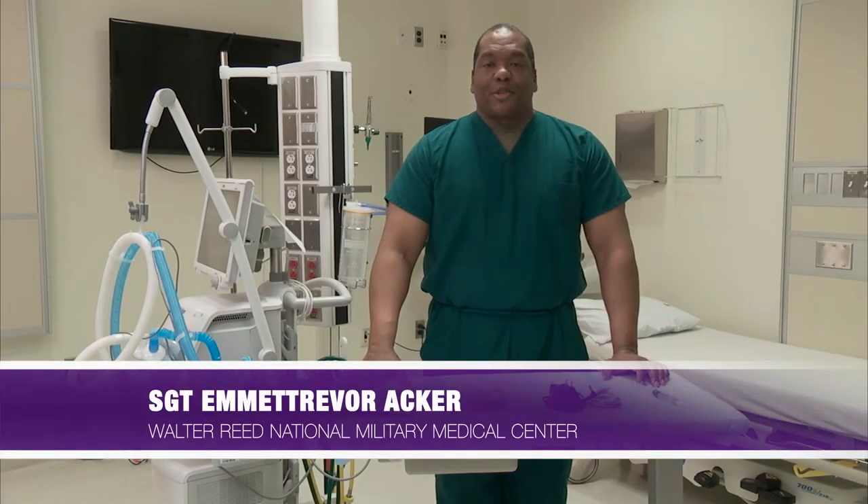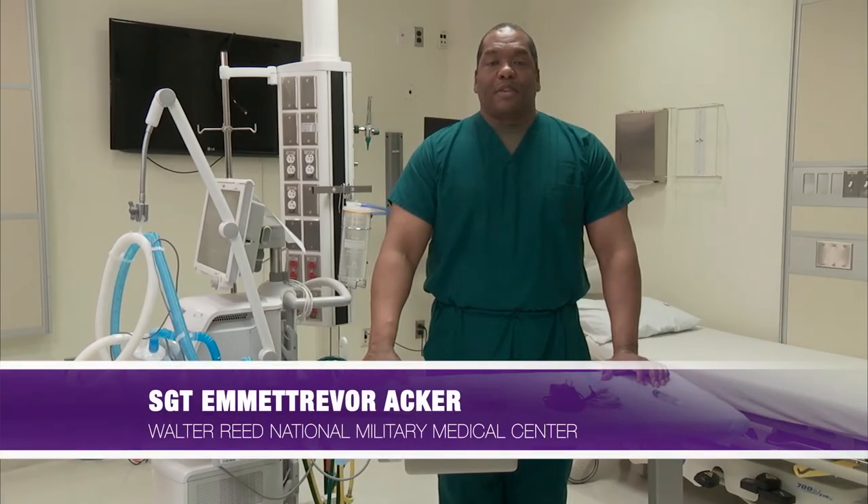Hi, I'm Sgt. Acker. I'm a respiratory therapist here at Walter Reed, and I'm going to give you a brief overview of the Aerogen Aeroneb system.